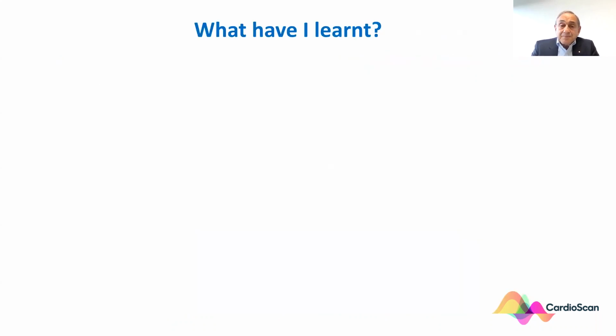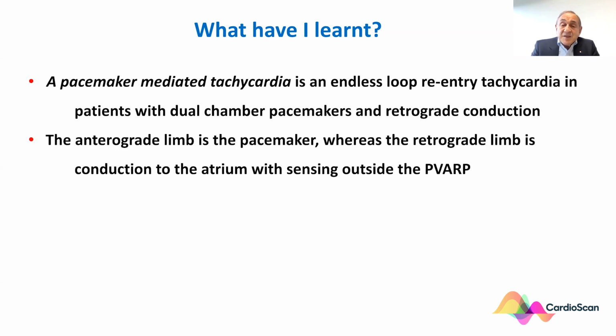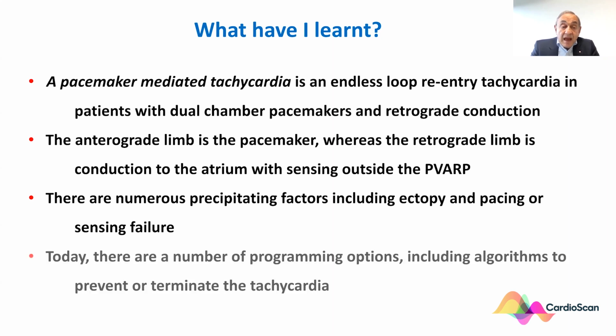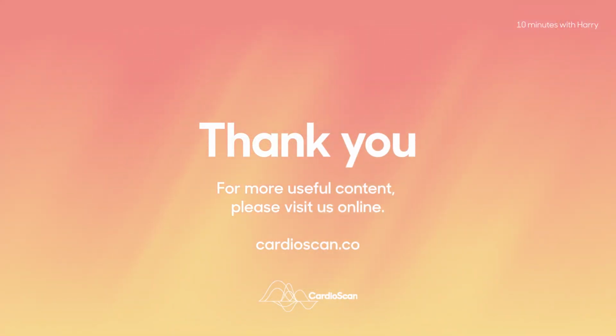So what have I learned today? A pacemaker-mediated tachycardia is actually an endless loop re-entry tachycardia in patients with dual-chamber pacemakers and retrograde conduction. The anterograde limb is the pacemaker, whereas the retrograde limb is conduction to the atrium with sensing outside the PVARP. There are numerous precipitating factors, including ectopy and pacing or sensing failure. And today there are a number of programmable options, including algorithms, to prevent or terminate the tachycardia.